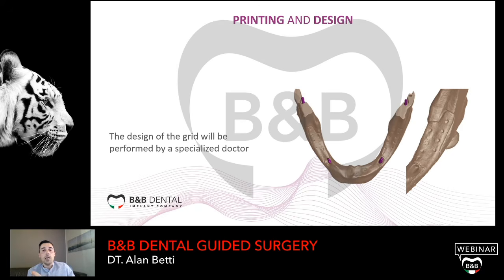The design of the grid will be performed by a specialized doctor. If you want, you can design your Juxtagrid, it is not a problem, but we also have specialized doctors that can design the path of the Juxtagrid.